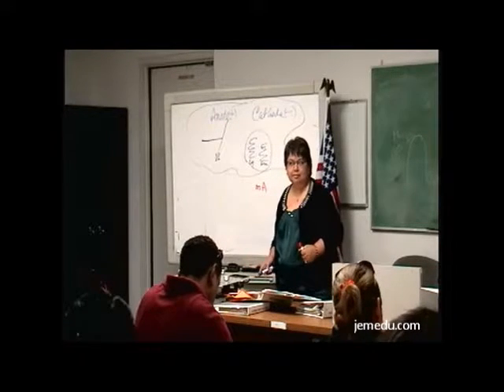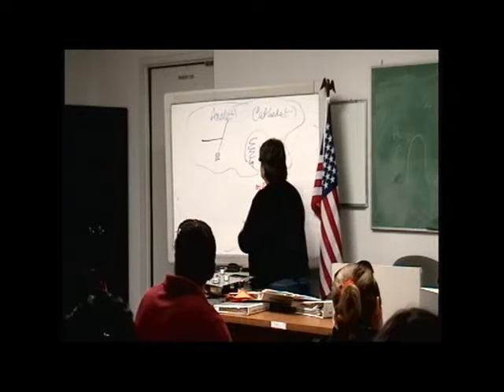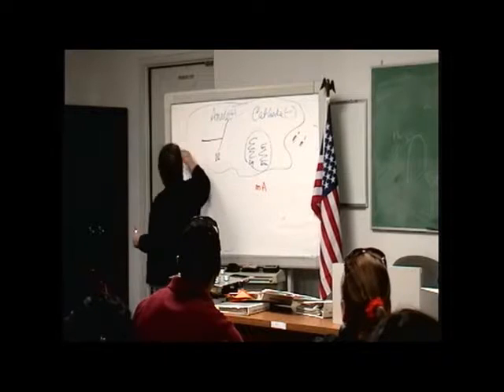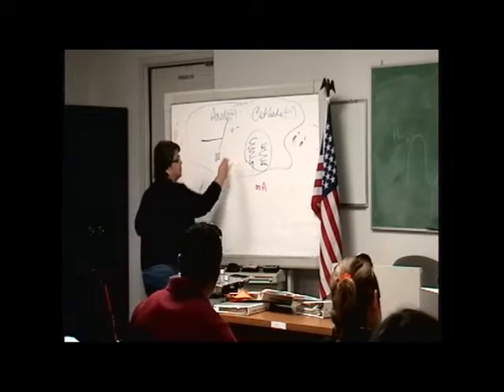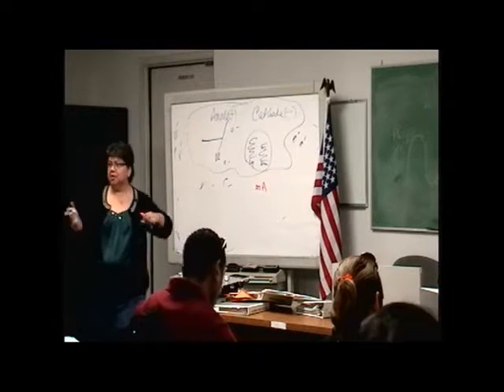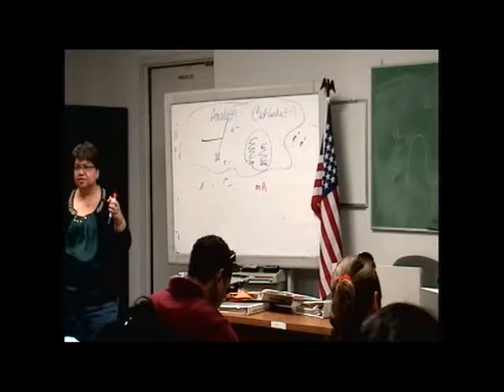Because of electrons. What particular kinds of electrons? Excited ones. No, not so much excited ones. Oh, the free electrons. We've got free electrons out here, and if I had free electrons all over the place, what would happen the moment we made our exposure? Those electrons would also be wanting to go to the target. Those are not part of what we are selecting to produce X-ray.